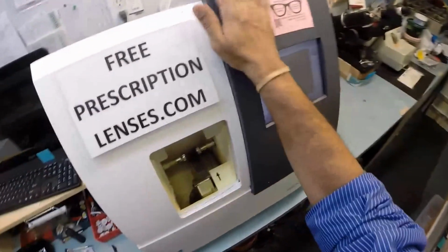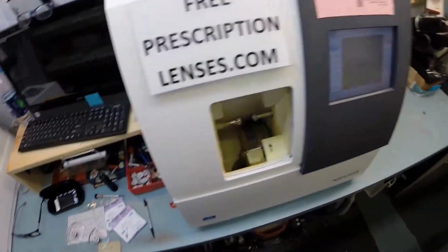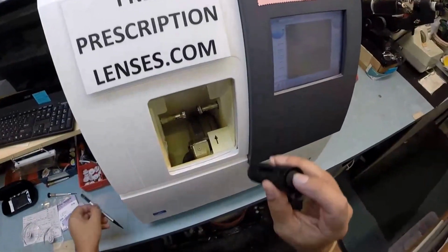Now this is the edger. This is what costs $40,000. It weighs 200 pounds. I recommend everyone go out and buy their own. Then you can cut your own lenses at home. You won't need me anymore.